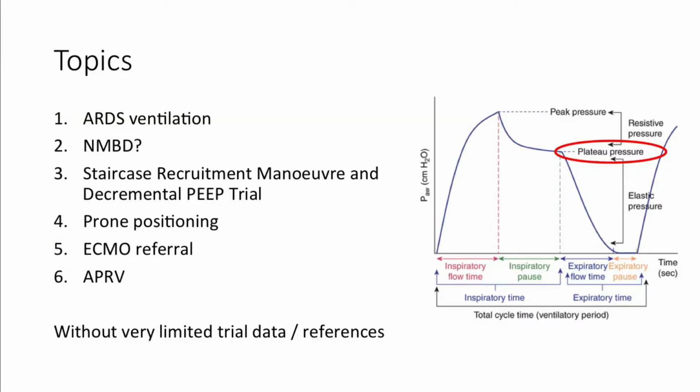So we're going to talk about ARDS. I'm going to cover ARDS ventilation, when we use neuromuscular blocking drugs, the staircase recruitment manoeuvre and decremental PEEP trial, which is quite a mouthful, and we'll cover that. Is anyone used to that already?